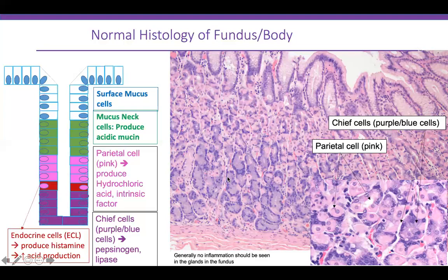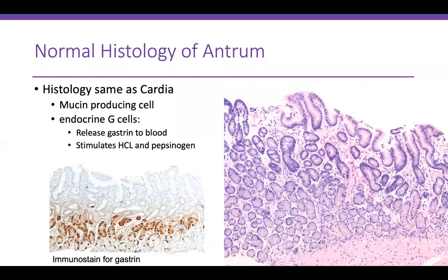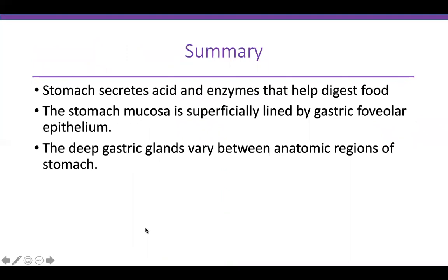Normal histology of the antrum looks similar to the cardia on H&E stain. However, the antrum is distinguished by endocrine G cells, which release gastrin into the blood to stimulate production of hydrochloric acid and pepsinogen. Using immunohistochemistry, we can stain for gastrin and highlight these G cells in brown, as seen in this immunostain image.